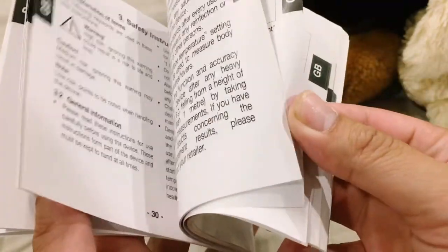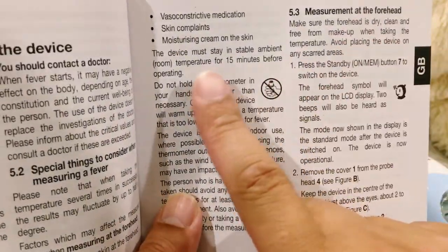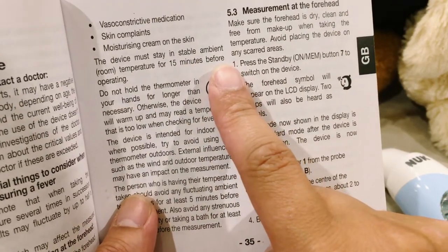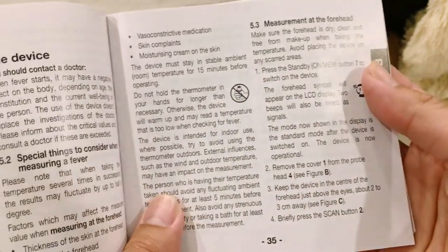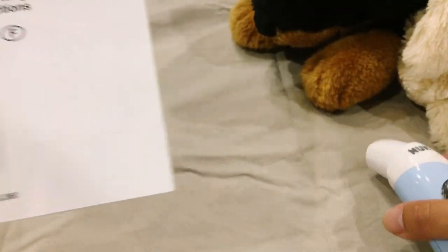Lastly, it is essential to leave the thermometer in the same room you are going to use it. For example, if you are going to measure your baby's temperature, leave it in the same room as your baby for 15 minutes beforehand. If in doubt, please read the user manual.